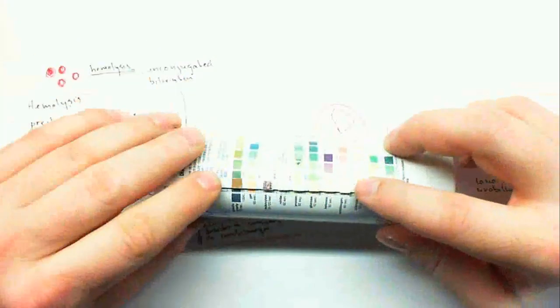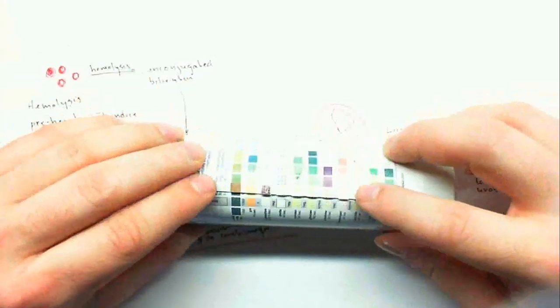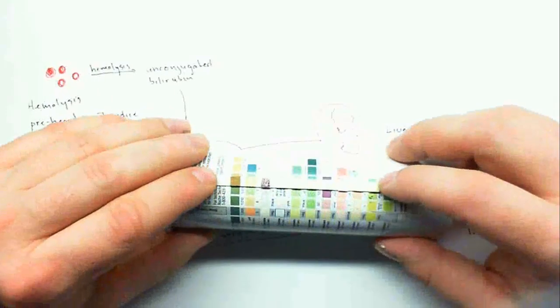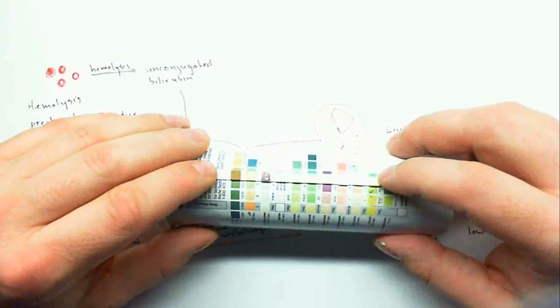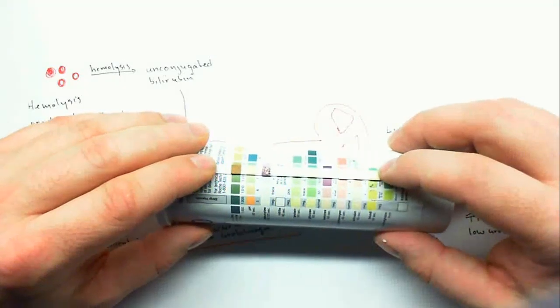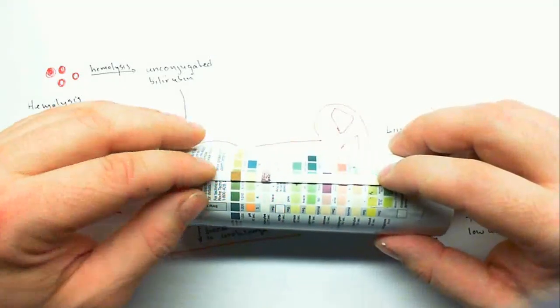In this one, I'm trying to indicate dehydration, so there's a really high specific gravity. There's also leukocytes present, and that could indicate any kind of infection that's causing diarrhea or throwing up, causing dehydration, and there's clearly also an infection.